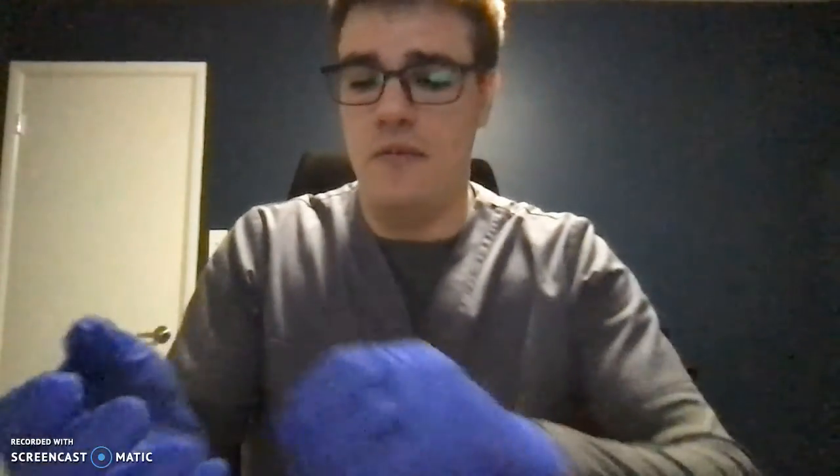We, again, would not recap this. We would just put the safety on it, and then we would put it in the sharps container, which is a red container that's usually in the room. And then we would go ahead and remove our clean gloves and go ahead and do hand hygiene. So rewash our hands, use hand sanitizer, and then we're going to document.